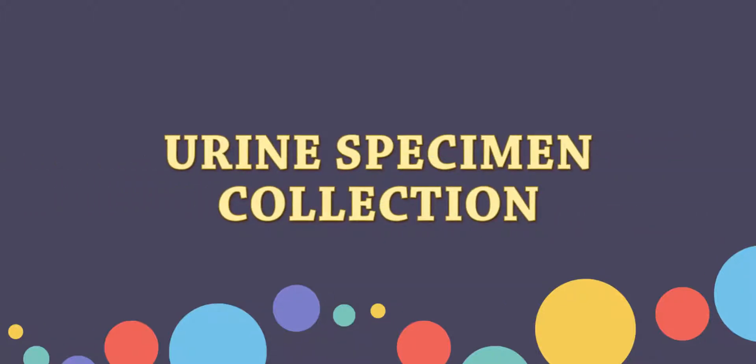In this video, I'll be showing you how to take a sample of urine. Our objective for today is to learn how to collect the urine specimen.